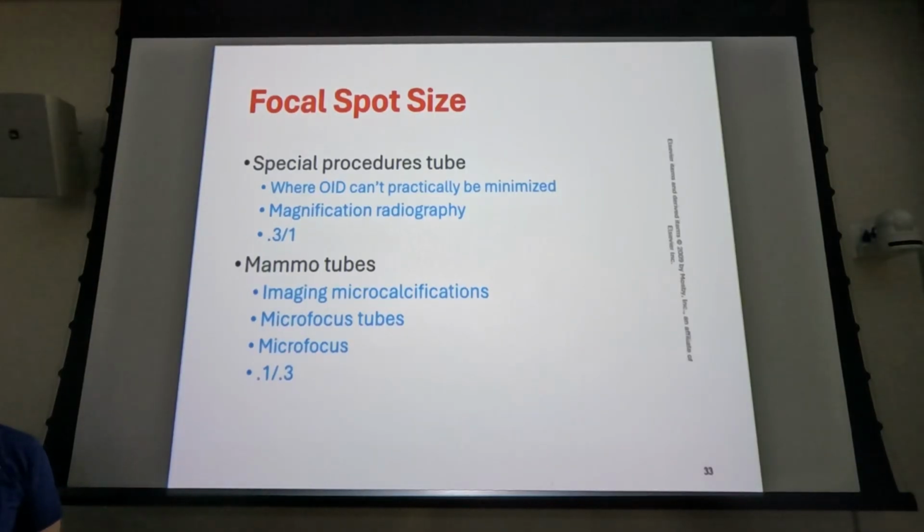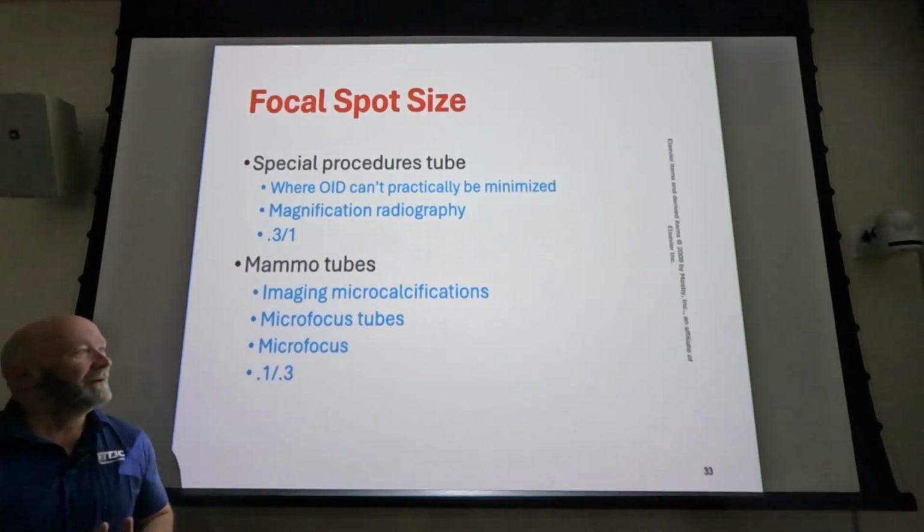What's 100 kVp on a small focal spot versus a large focal spot? 100 kVp, right? So in as much as changing the quantity or quality of the x-ray that's coming out of the tube, focal spot has no effect. With one distinct possible difference. It's not really a difference, but if you're not paying attention to the question on the test, it'll kind of trip you up. That was a Freudian slip, trick you up.